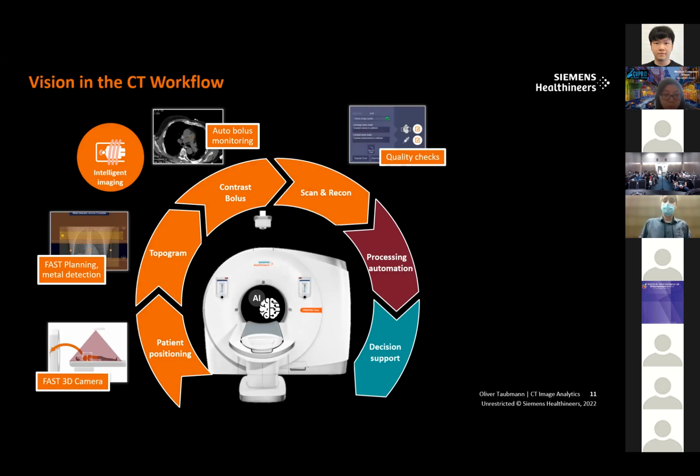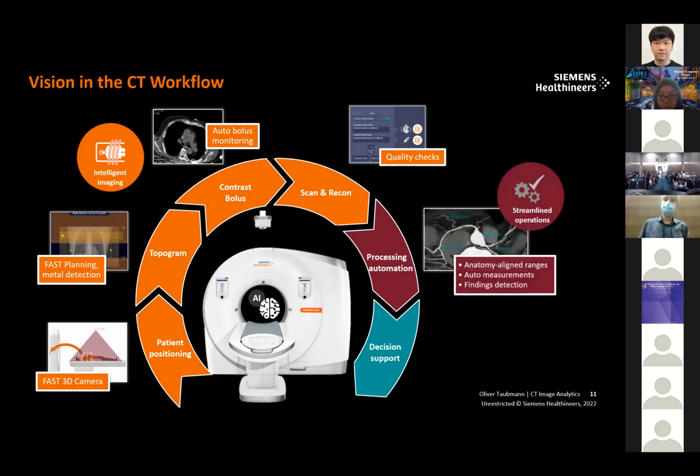And then once we have acquired images that we are satisfied with, there's of course a lot of processing that we can do to facilitate reading of the images.